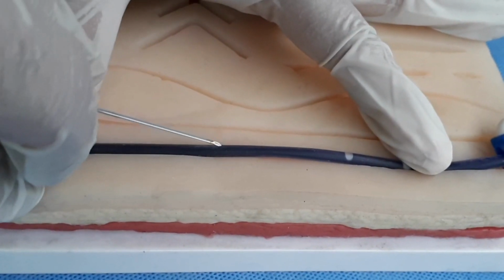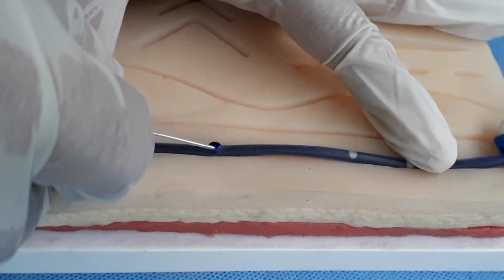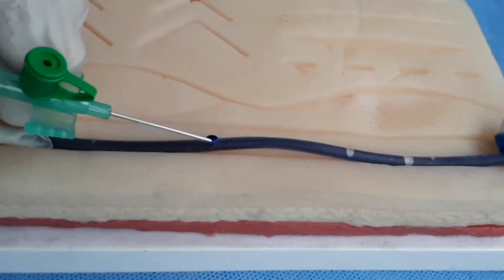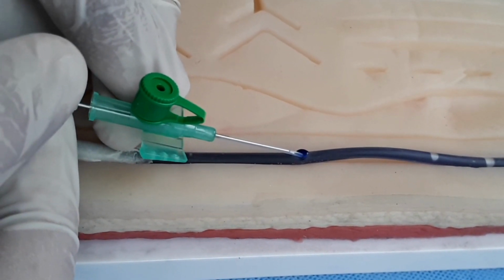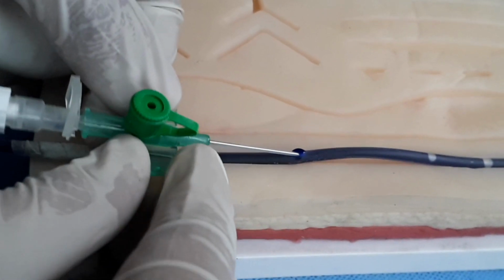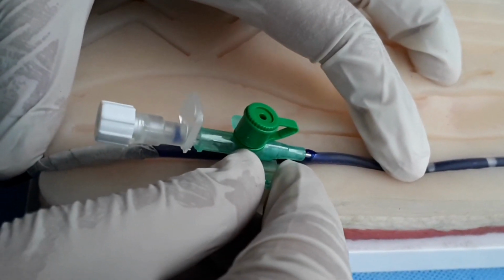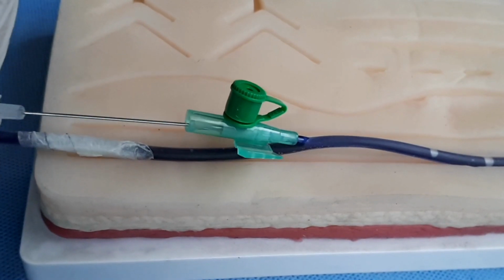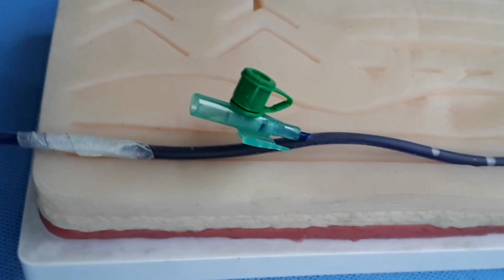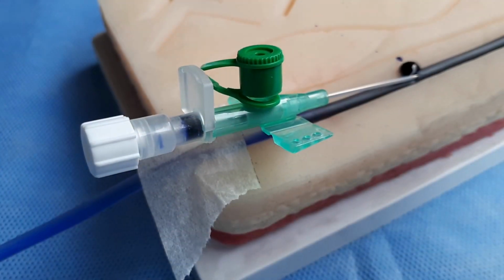This is a small demonstration of the cannulation procedure. After the identification of the vessel, the needle of the stylet is inserted into the vessel. Once the bevel of the needle is within the vessel, there is a flash of blood in the flash chamber. Once there is a flash, the cannula is advanced slightly within the vessel and the stylet is slightly pulled backwards. After this, the rest of the cannula is pushed within the vessel and the stylet is removed. The luer lock plug is secured with the luer connector. This is how a flash looks in a flash chamber.